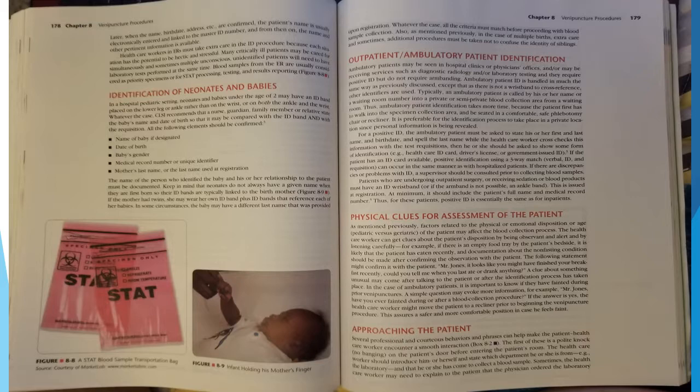Physical clues for assessment of the patient. As mentioned previously, factors related to physical or emotional disposition or age, pediatric versus geriatric, of the patient may affect the blood collection process. The healthcare worker can get clues about the patient's disposition by being observant and alert and by listening carefully. For example, if there is an empty food tray by the patient's bedside, it is likely that the patient has eaten recently, and documentation about the non-fasting condition should be made after confirming the observation with the patient.